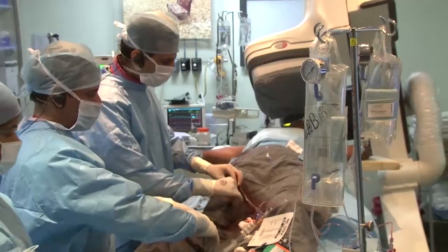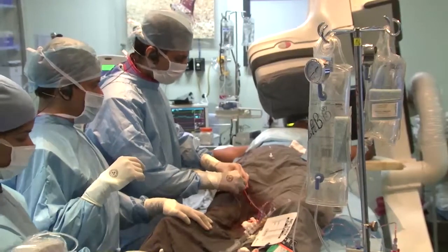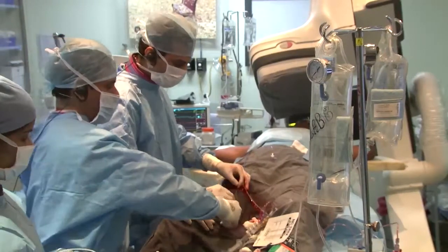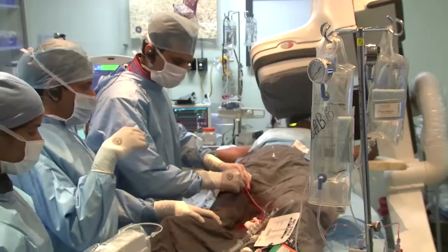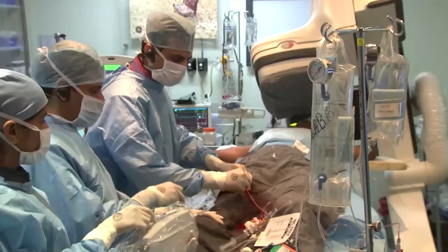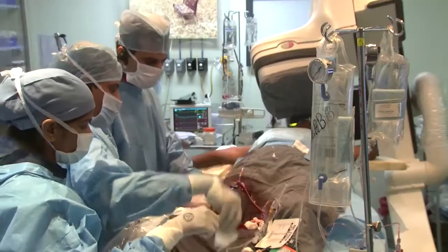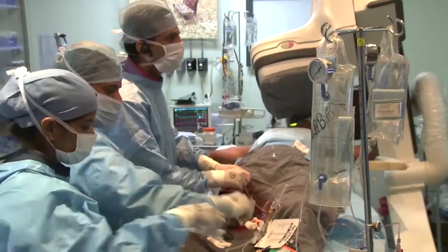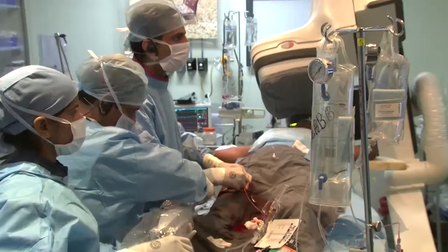I think the final POT should be done in all cases. I guess that's the recommendation now universally, that if you want to avoid disrupting the architecture of the main branch stent, a final POT after any kissing balloon is recommended. So we will complete it with the final POT after the OCT.